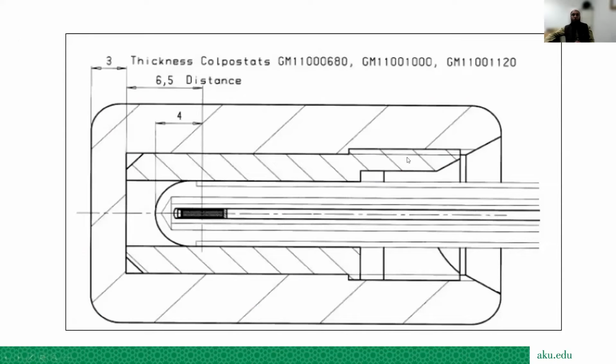This is vendor provided information which should be used for the nominal distances, and you can see the different distances available here. With these distances, you can put them in as nominal distances, which are provided by the manufacturer. And against these distances, you can measure your own distances.